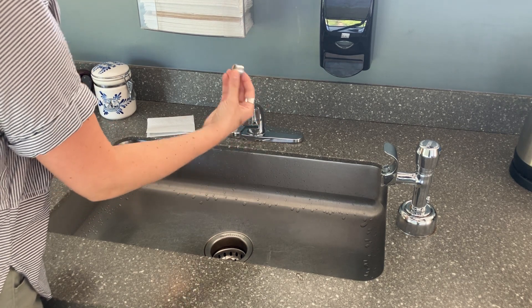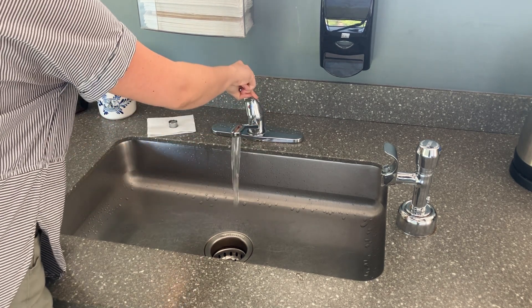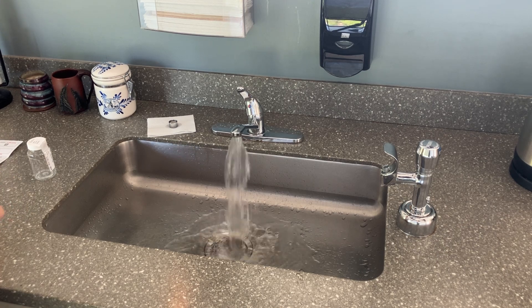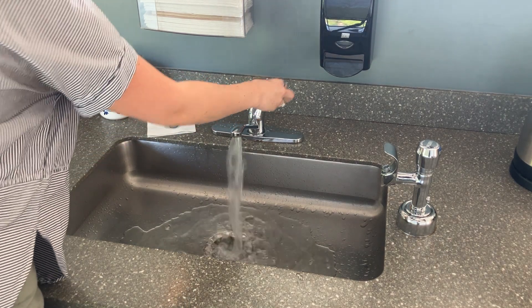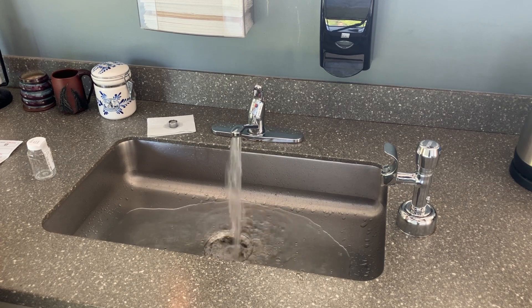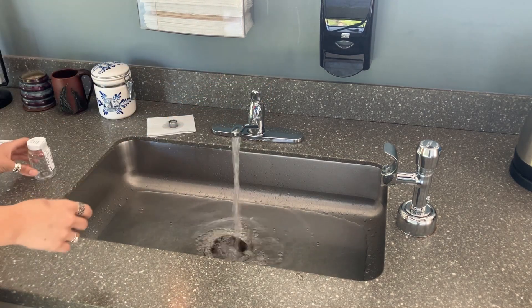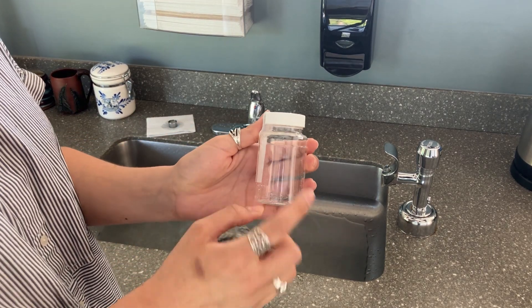If you have a single handled faucet, run the hot water for two minutes and then the cold water for two minutes. If you have a dual handled faucet, run the cold water on high for three to five minutes to flush your pipes. Lower the flow by half and fill the bottle slightly above the 100 milliliter line.